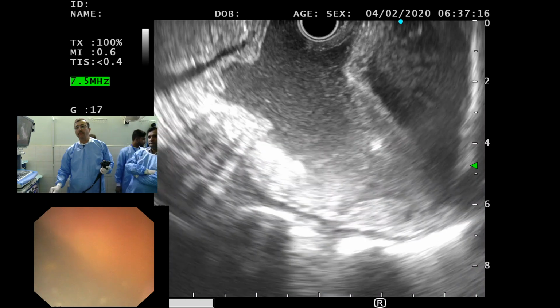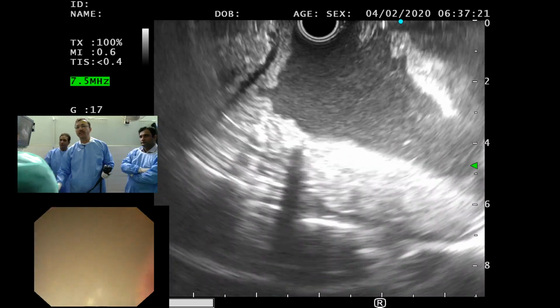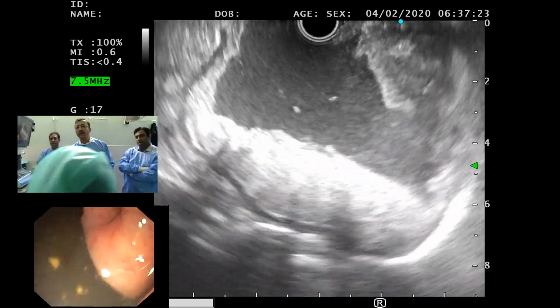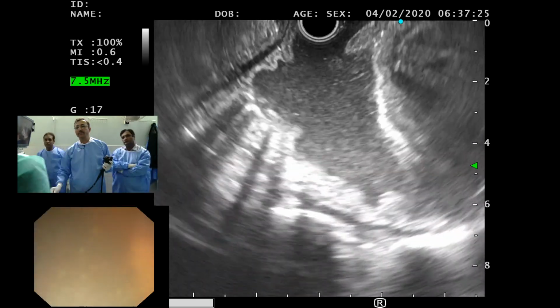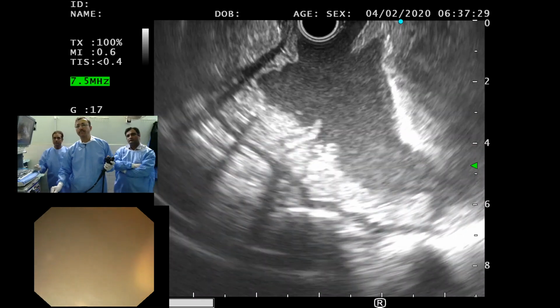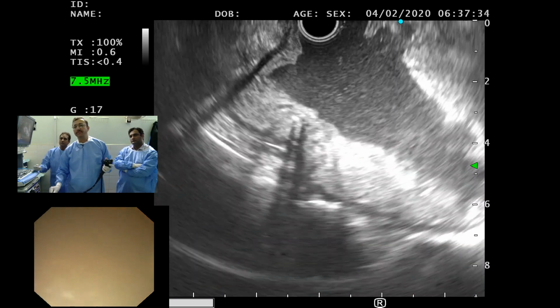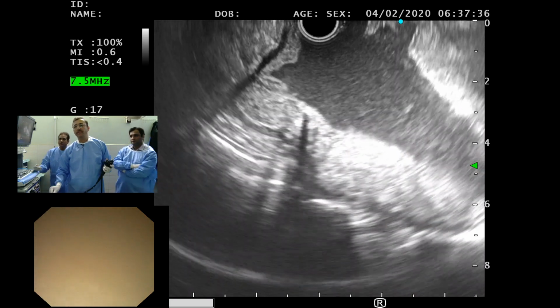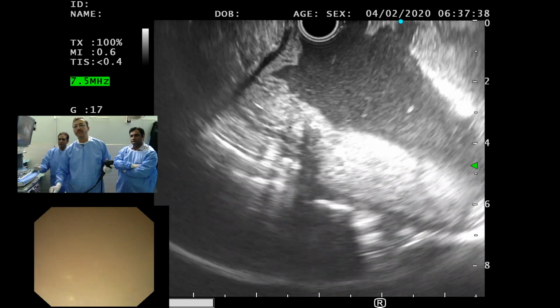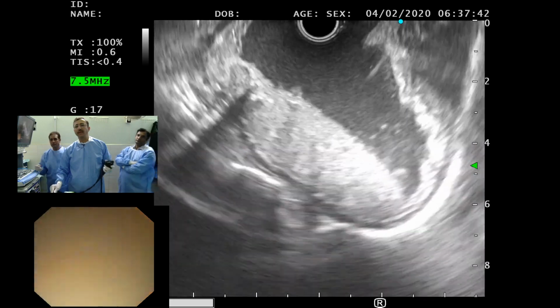So is that because the patient is obstructed? Most likely, there has to be some kind of obstruction distally. Otherwise, this fluid is telling you that. She's not eaten anything. It's more like a clay fluid or muddy fluid. While you were screening, we saw the neck area of the pancreas, and we saw the pancreatic duct is prominent.